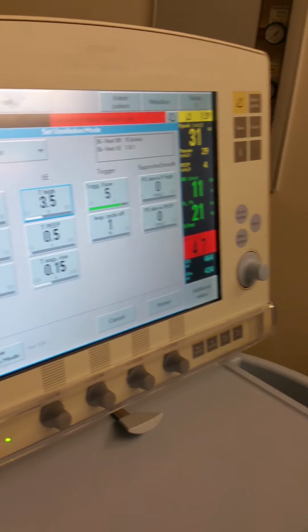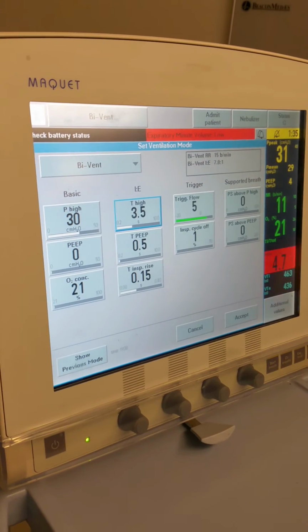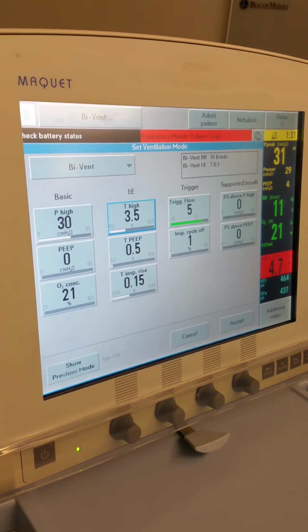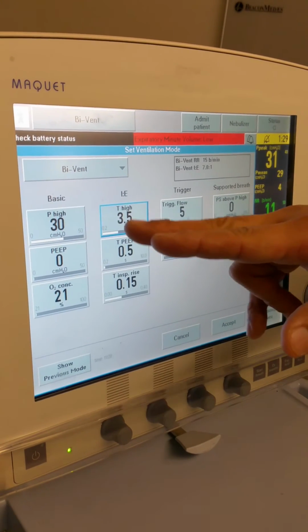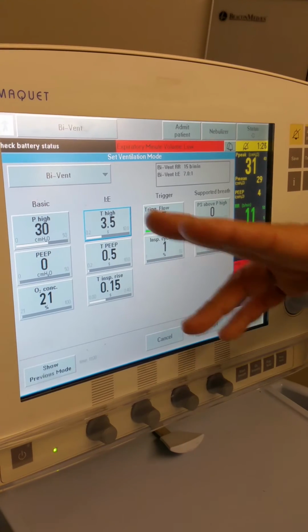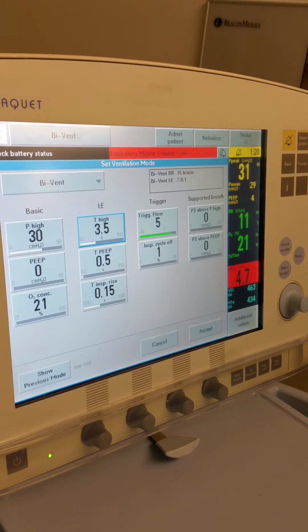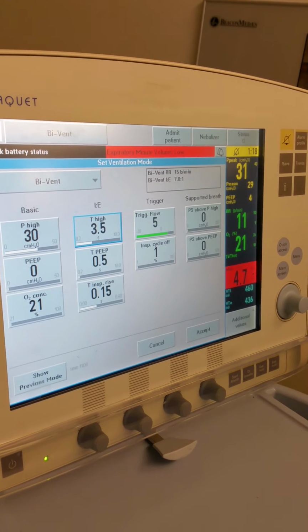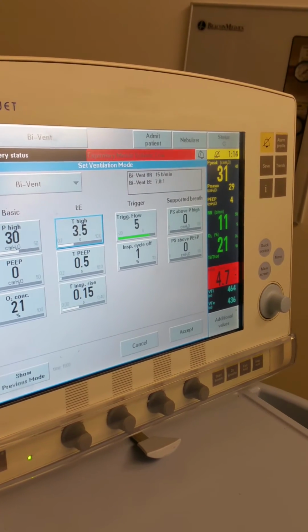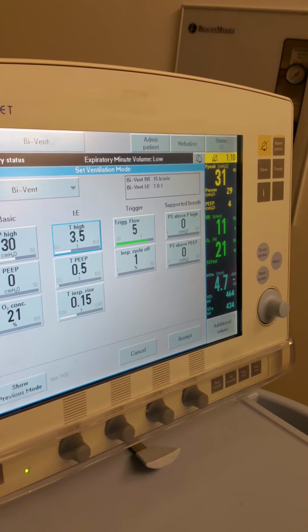Does that make sense? So CO2 issue, shorten your T high. If I'm blowing off too much, then I'm going to actually make that higher, right? But remember, the lower we go on this, we're giving up mean airway pressure. So if I make a really drastic change, what might happen to my SpO2 or my PaO2? It may go down because you're giving up a little bit of mean airway pressure. Does that make sense? So you're kind of having to balance the two of them.